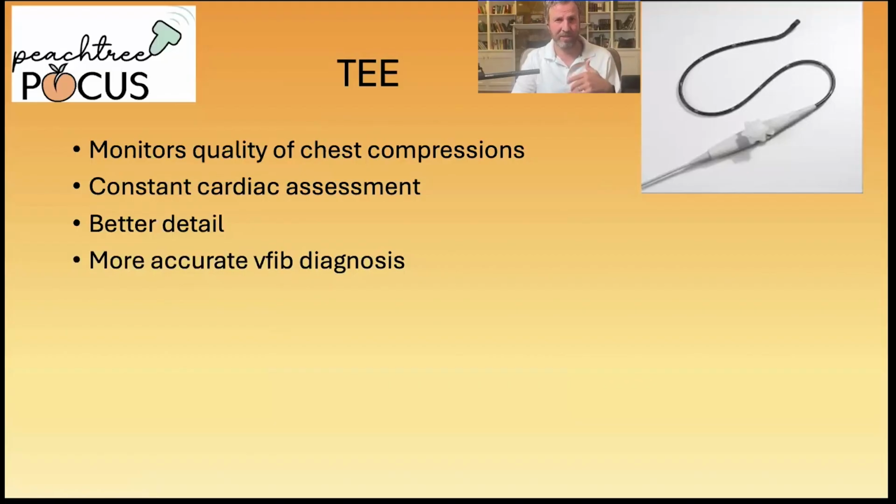With the probe in the esophagus, you can see exactly where the compressions are landing in real time. Are they really squeezing on the left ventricle, or are they on the outflow tract and actually hindering resuscitation or somewhere less effective? So you can guide the compressor's hands in real time, or if you have a LUCAS or automatic compressor device, you can adjust its positioning in real time.